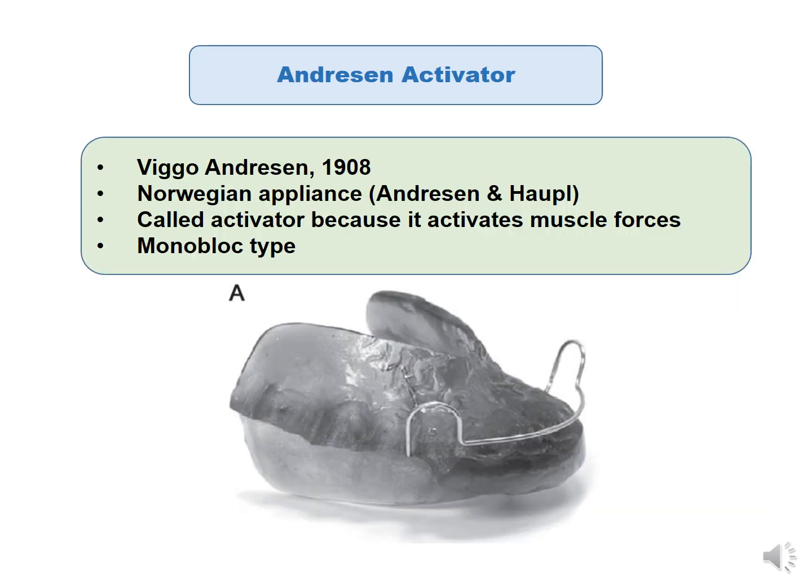Let's have a look at the Andresen activator. This was introduced by Viggo Andresen in 1908, and it later became known as a Norwegian appliance, and it is called an activator because it activates muscle forces. Now, the activator is a monoblock type of appliance.